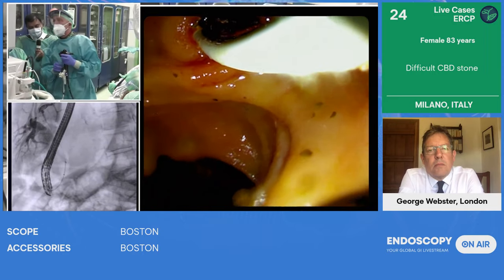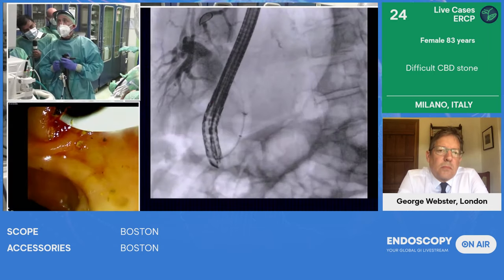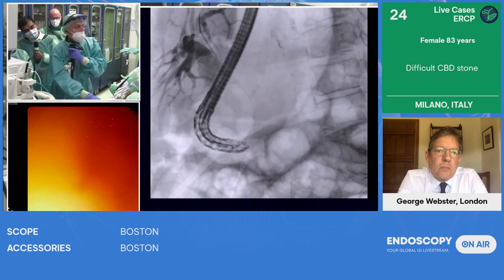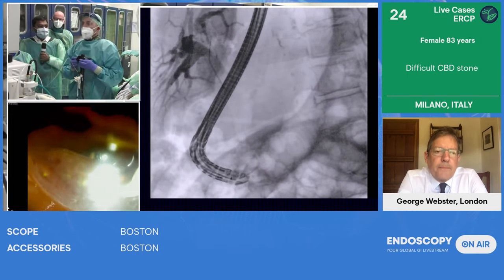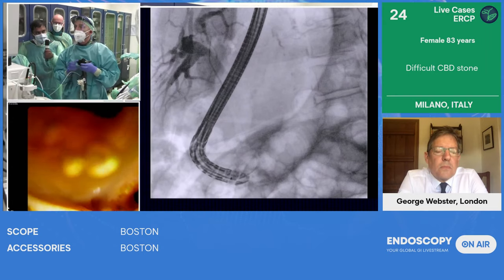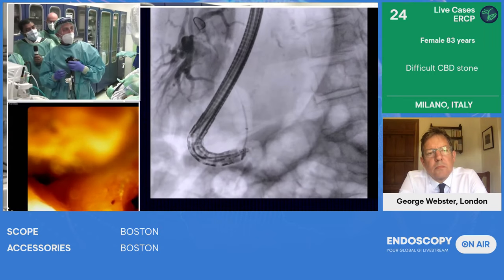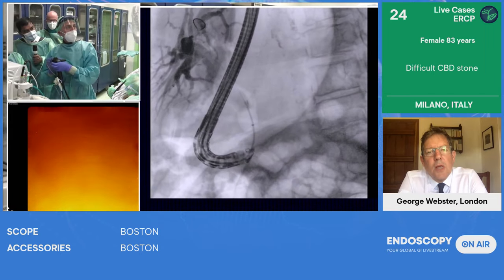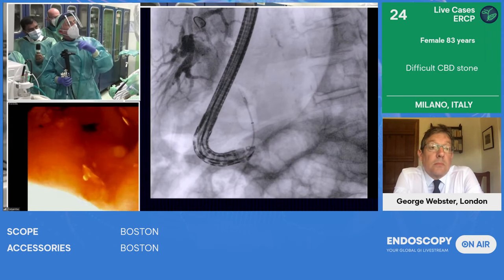We can show it radiologically. Yeah, yeah. Thank you, Shyam, for remembering this. This is a very, very big balloon, probably with very big stones here. And you can do this maneuver. Right, down. Yeah, that's it. And that's it. I think this is one advantage of the single use, particularly this scope. If you look at the cholangiogram or the fluoroscopy image, the axis of the scope is fairly perpendicular, which makes dragging of the balloon very, very easy.